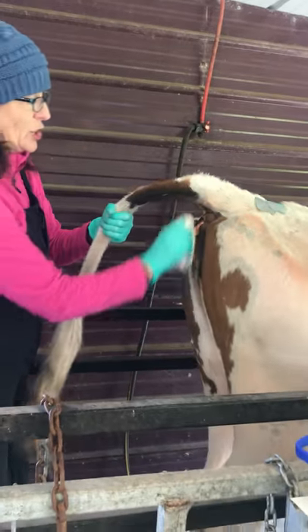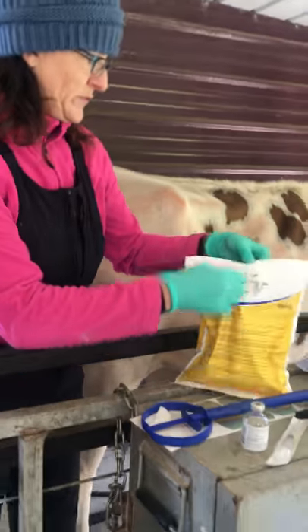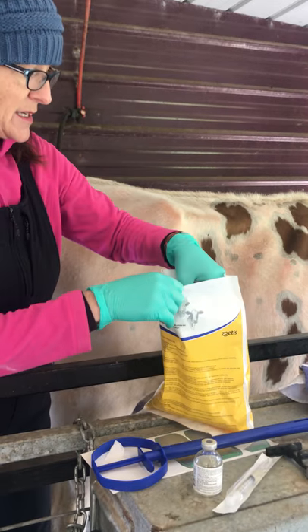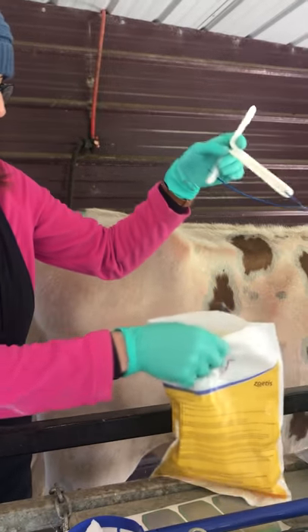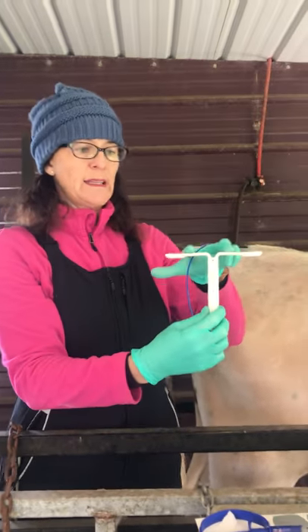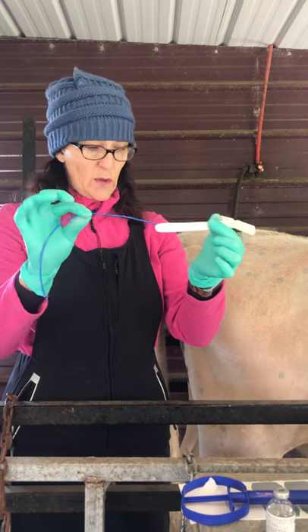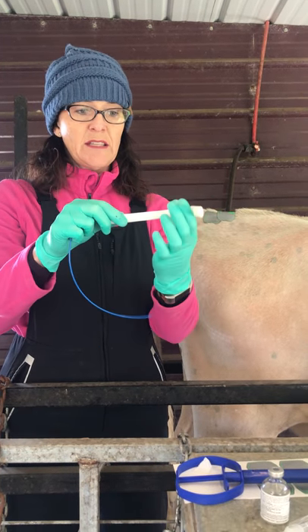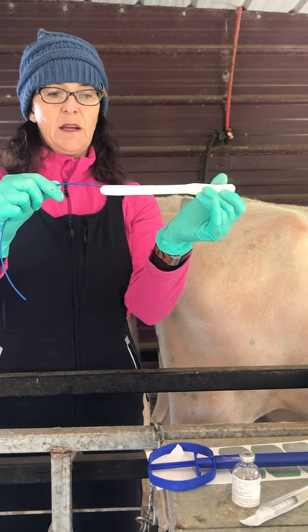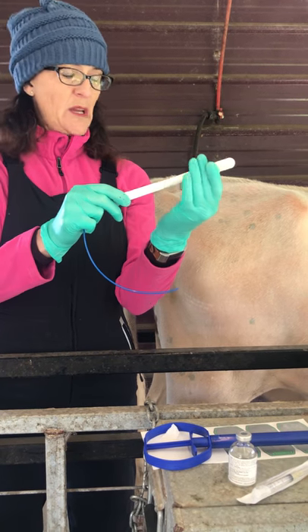She's not going to like this but it's not going to hurt her. So I'm going to take a CIDR — they come in a pack of ten, so they're not cheap because you have to buy ten at a time. Now here's how it works: it has wings that are going to hold it in her vagina for seven days, and it has a little tail so we can pull it out when it's time. When I insert it, these wings have to go up and go in like this, so when I pull it out those will catch and keep it in.